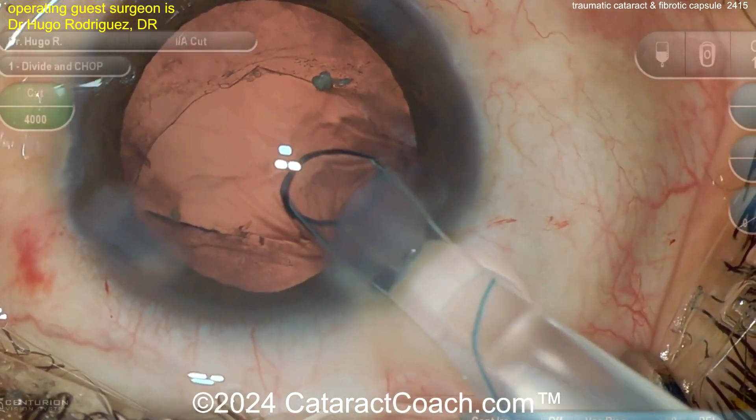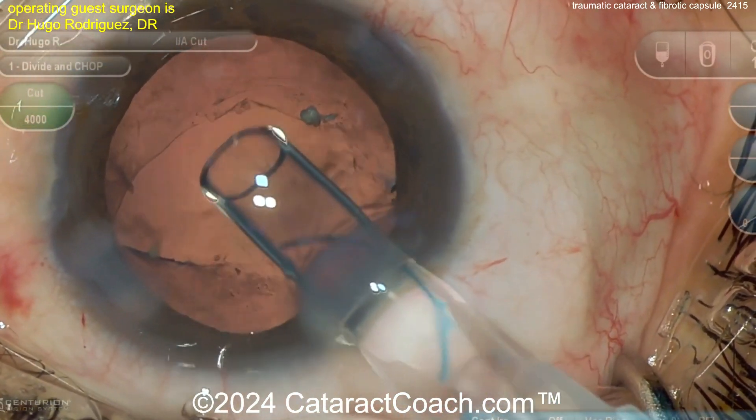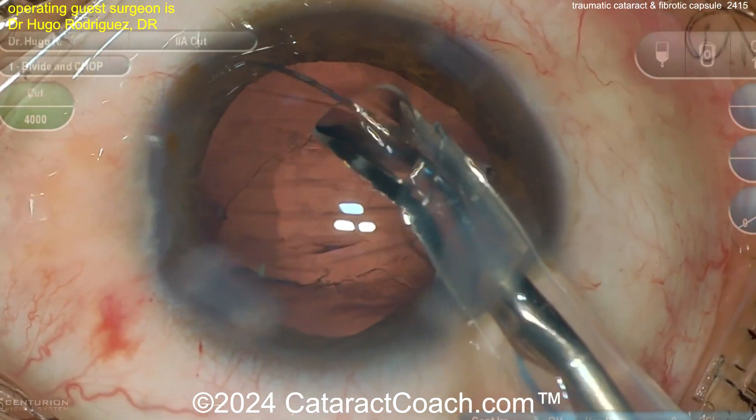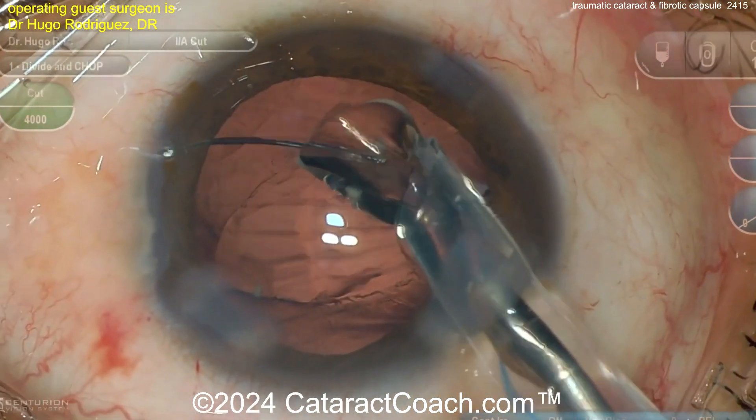When you do that you should be able to get out most of this lens material. Here comes a lens — looks like a three-piece lens. Remember the 7L rule, you learned that on Cataract Coach. There's a leading haptic looking like a number seven — good, good, good.